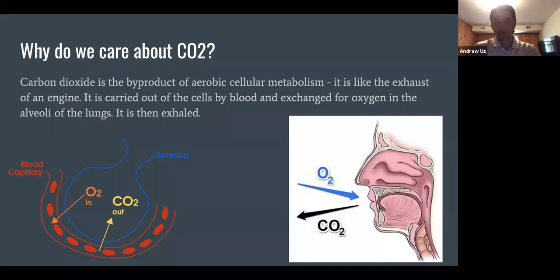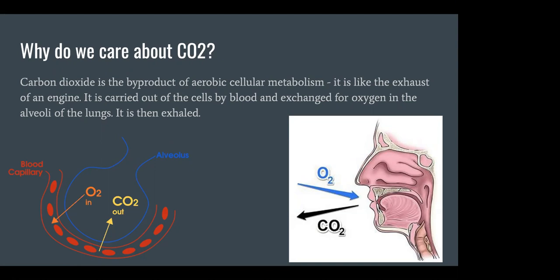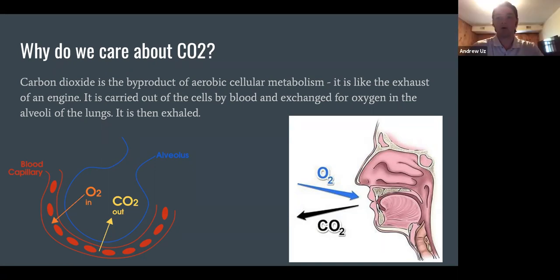So like I said, we're measuring CO2, or carbon dioxide. Basically, that is just the byproduct of cellular metabolism. So you breathe oxygen in, you breathe out CO2, and on a more micro level, the cells actually use that oxygen and then produce CO2 as a waste product. It's carried through the blood into the lungs, and then it's exhaled, which means that the air, so to speak, that you breathe out is actually composed of a pretty good amount of CO2.